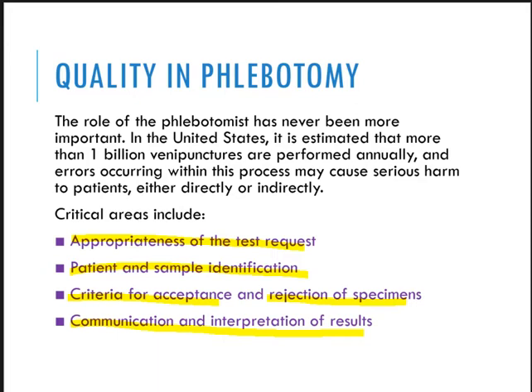Okay, so maybe the doctor will request a CBC for the patient, but then again, the laboratory request that the patient accidentally checked was for hepatitis. So please do take note of that one. But seldom rin siya mahitabo because most of the time, doctors usually prepare, or maybe nurses prepare this beforehand. Okay, and then we have our patient and sample identification.